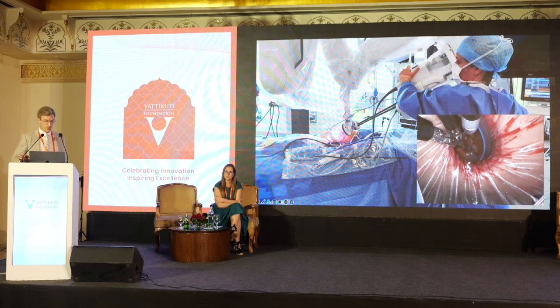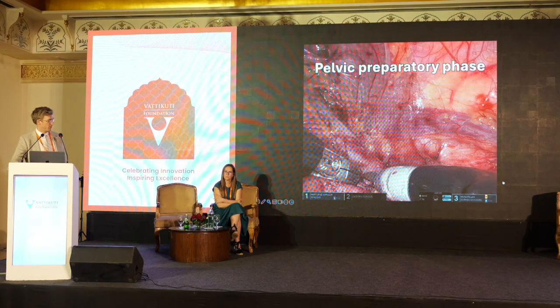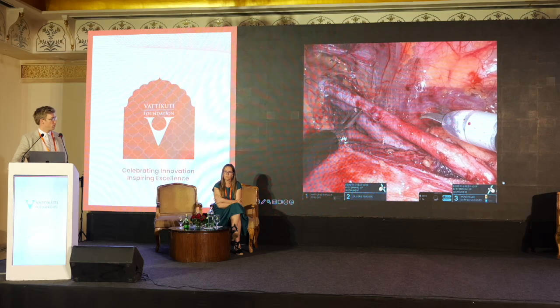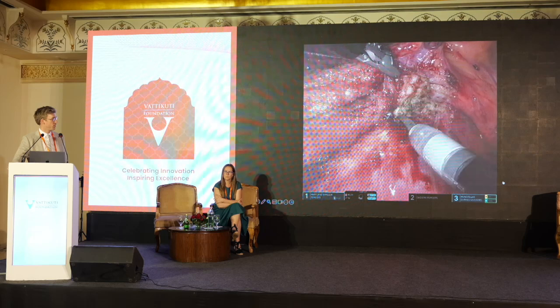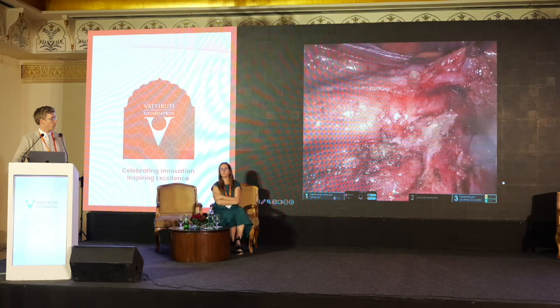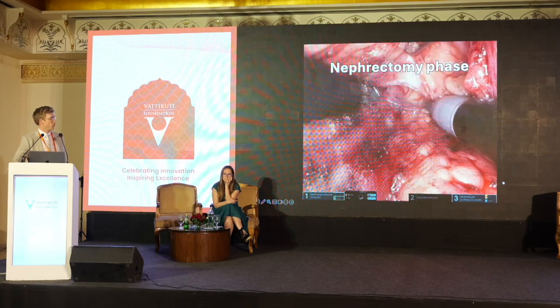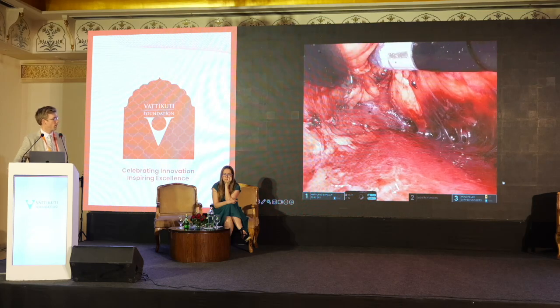So here you see the procedure at hand. We go in, we do the pelvic preparation. We dissect the iliac vessels, artery, vein, as well as the ureter. And when we follow this ureter, we take vessel loops, of course, for vessel manipulation. And here you see that very fibrotic ureter appearing. So this is really the stenotic part highlighted in yellow over there, which is very diseased. And so we follow it upwards, so the boom just rotates with us towards the kidney itself.